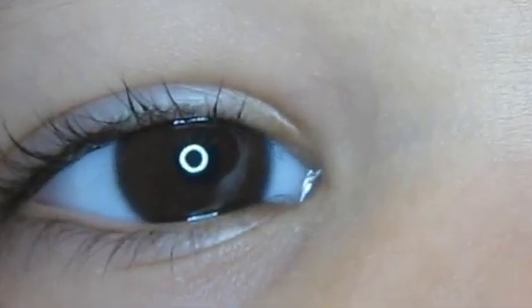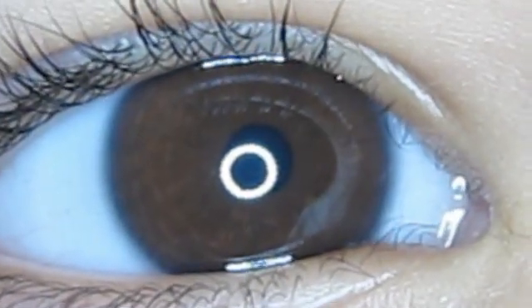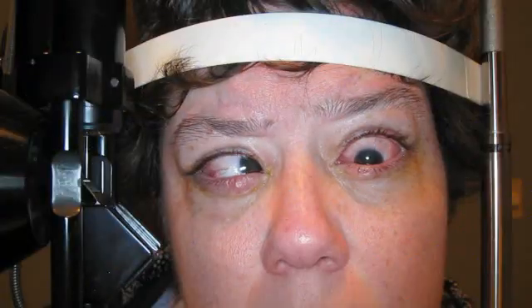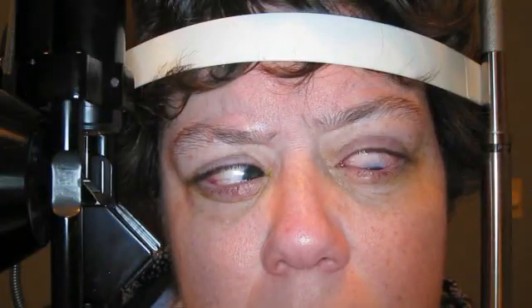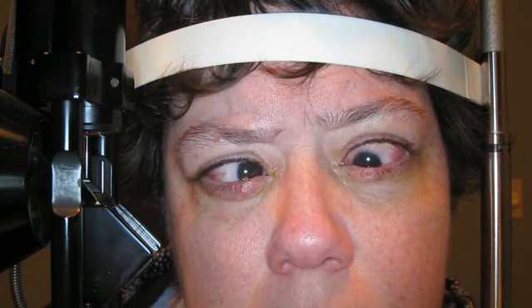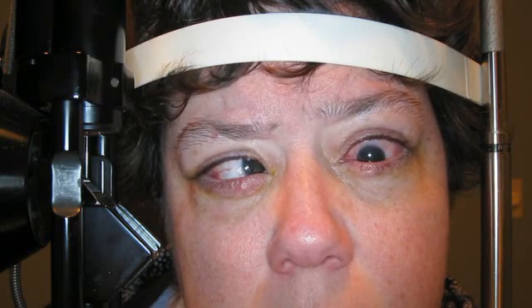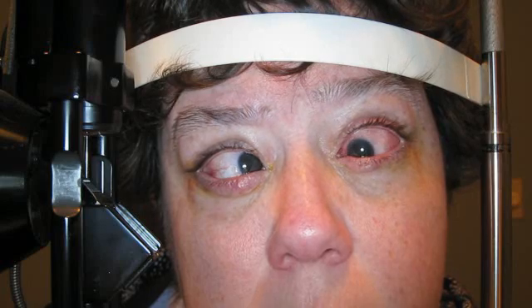The following clips were made using the Canon camera's video mode and the LED ring light. The first is a young lady with an anisocoria caused by blunt trauma to the left eye with a weighted plastic dart; she had otherwise normal eyes and ocular movement. The second patient recently had an orbital decompression for severe endocrine exophthalmos. Her condition is still unstable and she will ultimately require additional surgery for the induced strabismus.